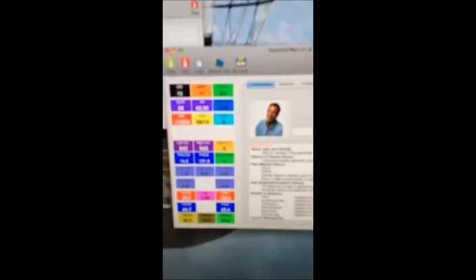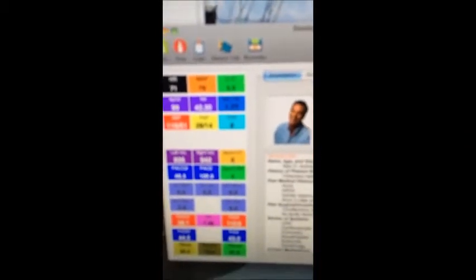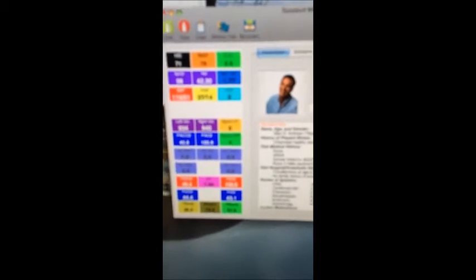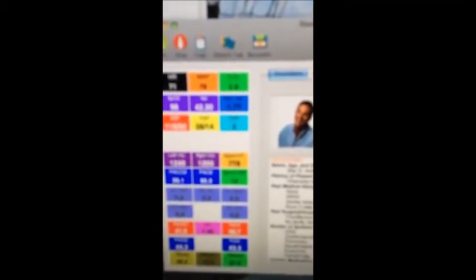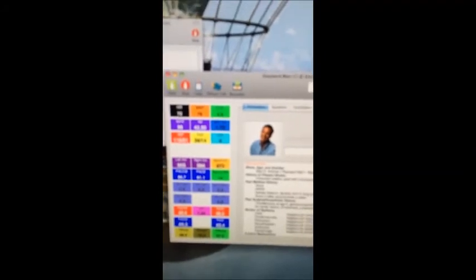What you'll see, again in these boxes, is that early on his PaO2 is actually quite high, and eventually it will drift down. Now it has happened, so his resps have gone to 0, and his PaO2 has to drift down a little bit, and often his CO2 has to elevate a little bit before he has an impetus to begin breathing again. And you can see now that he's breathing at 13 a minute, so he's ready to go. And that's how you start up Stan.